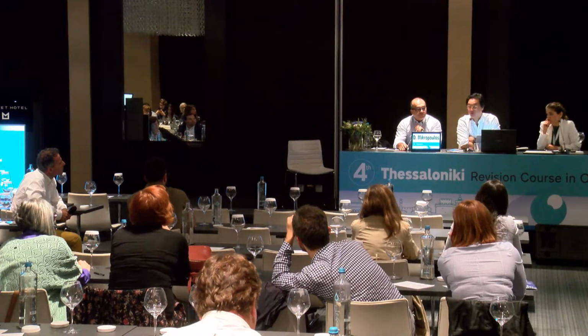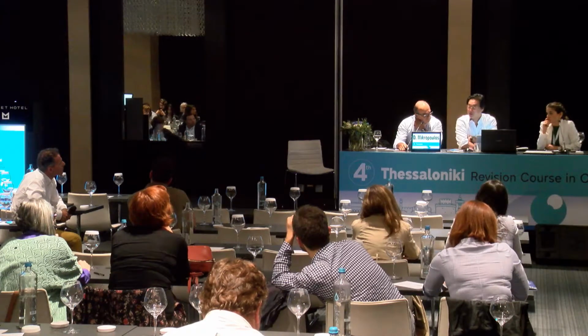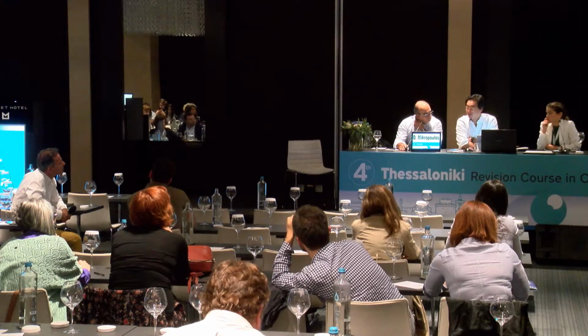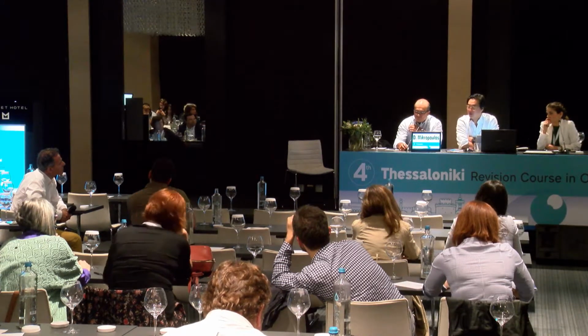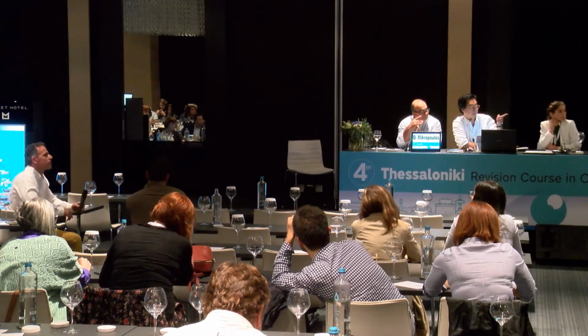But monitoring them with visual fields and OCT, likewise, I completely agree with the panelist that if you have a PPA that's encroaching where the scan ring is, there's no point in doing that. That's going to give you false data for monitoring the progression. Yeah.